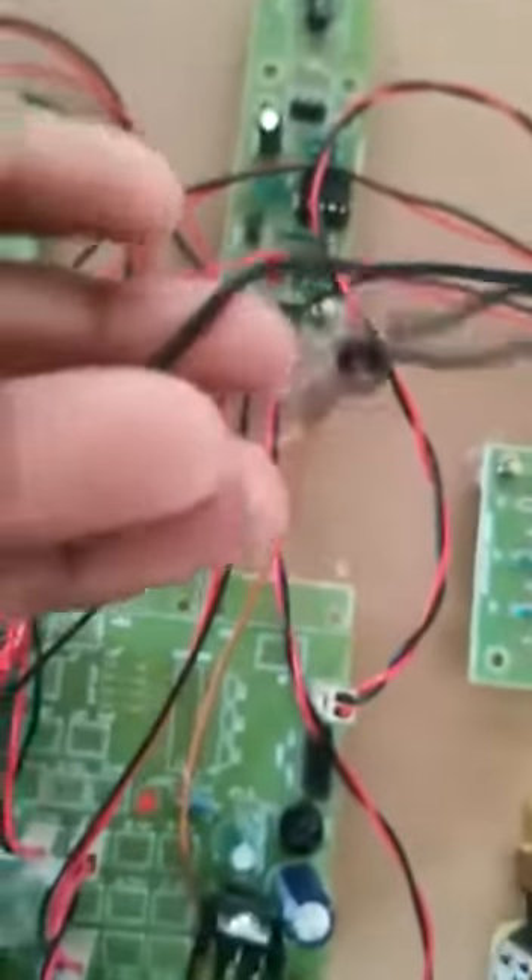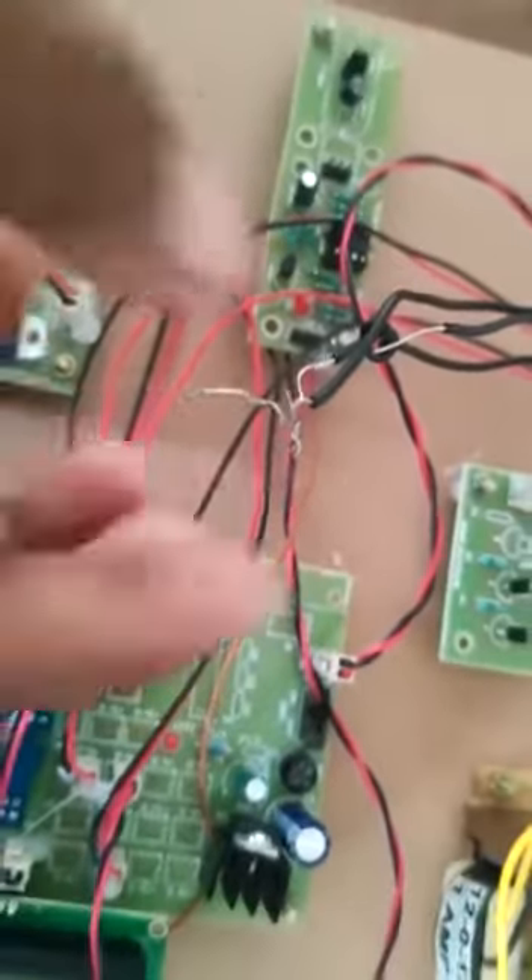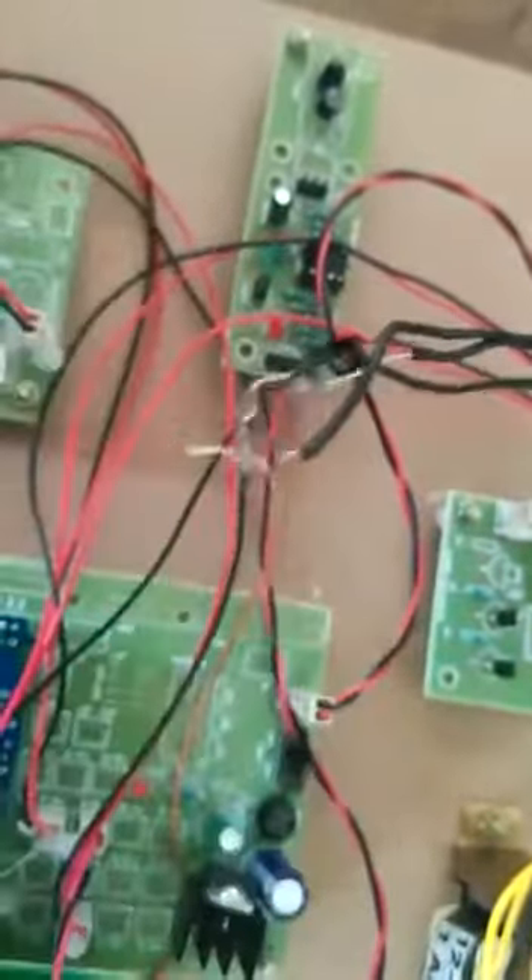This is the heartbeat sensor, which is used to measure the heart rate of the patient. This is the level sensor, which is used to determine the status of the liquid in the saline bottle. It has 3 levels: one for full, one for level 1, and one for empty.